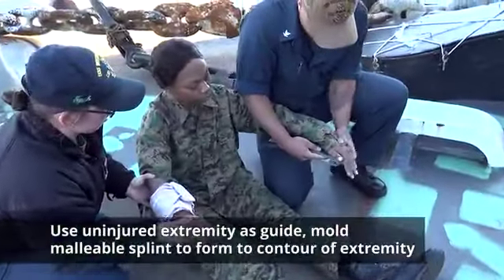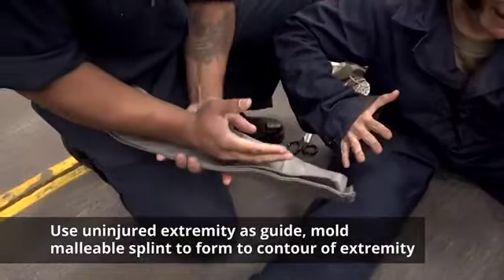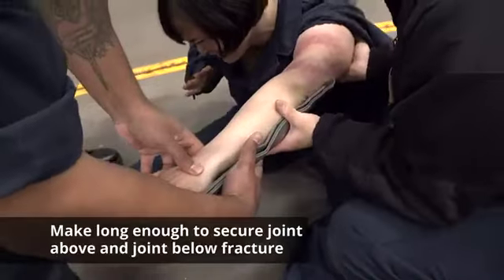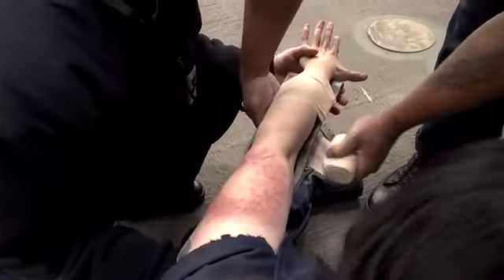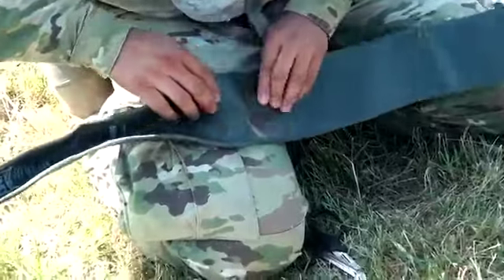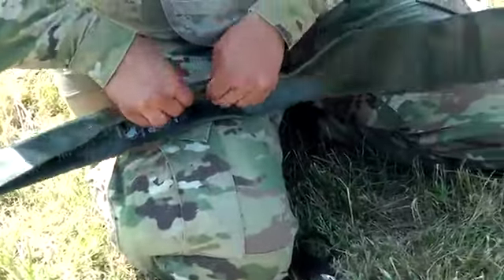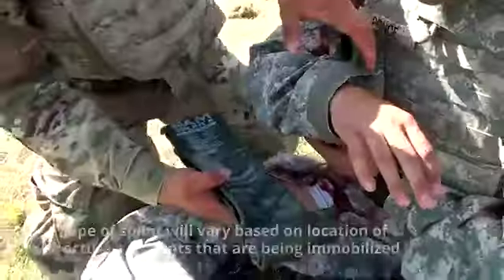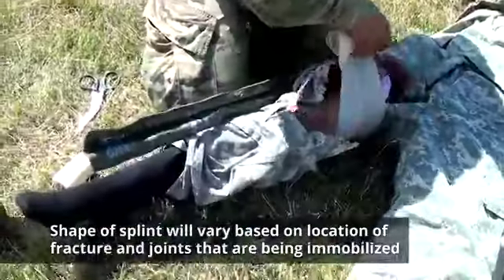Using the uninjured extremity as a guide, mold a malleable splint to form to the contour of the extremity, making it long enough to secure the joint above and the joint below the fracture. Occasionally, this will require two malleable splints secured together with wraps or tape. Malleable splints gain their rigidity by introducing curves and folds, particularly along the long axis of the splint. The shape of the splint will vary based on the location of the fracture and the joints that are being immobilized.